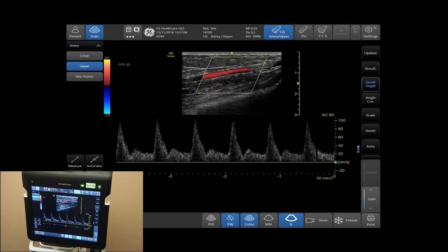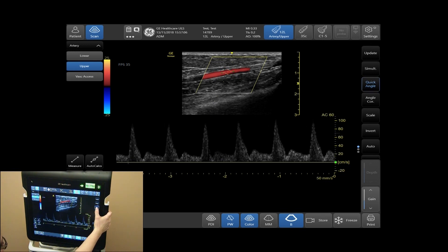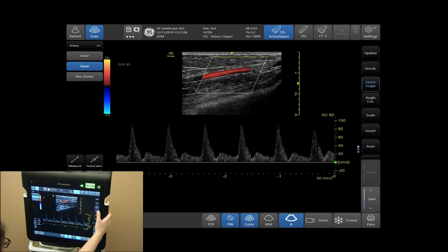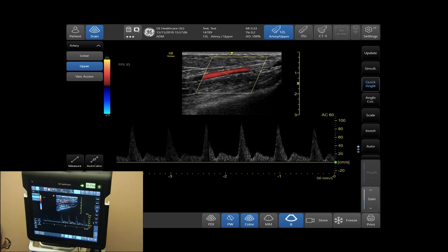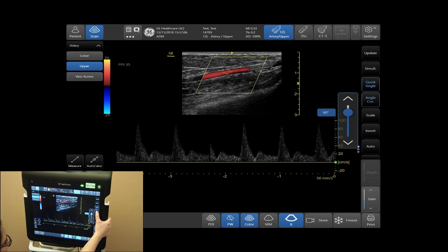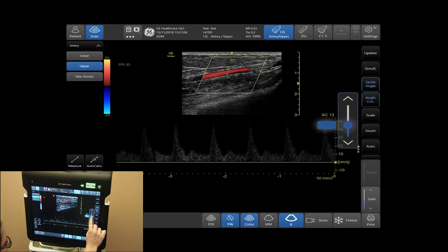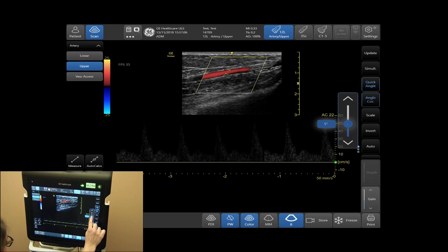For simple angle adjustment, tap on Quick Angle. This will steer your Doppler signal from left to right. To angle correct, tap Angle Correct. Here you can adjust the degree of angle at which your Doppler signal will be displayed.